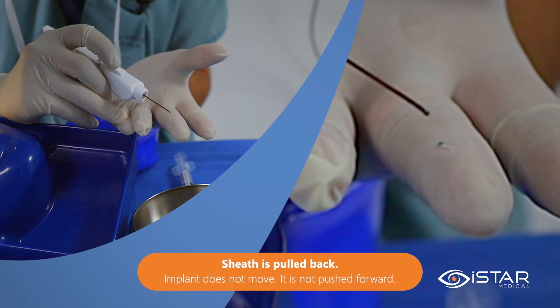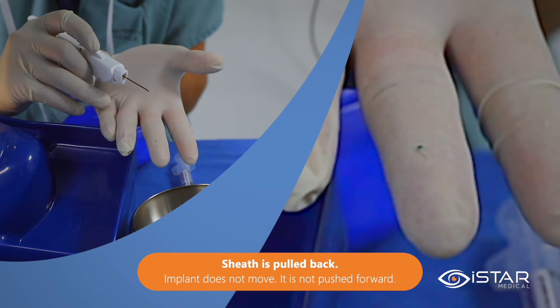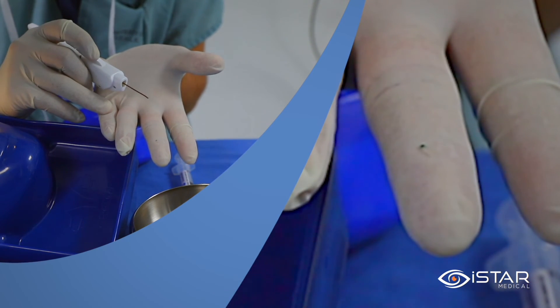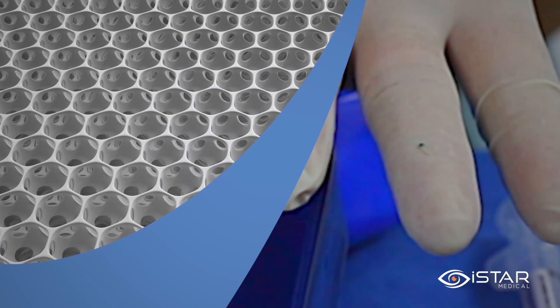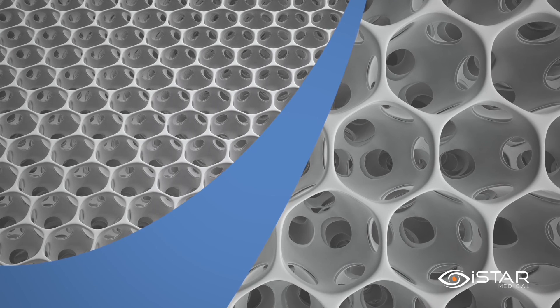Here you can see the actual implant on my finger. It is made of soft and flexible medical grey silicone and so easily conforms to the eye anatomy. The material is called STAR. It is biocompatible and minimizes fibrotic reaction due to its unique structure, composed of an organized network of interconnected hollow spheres.